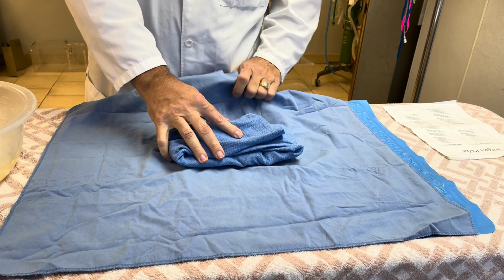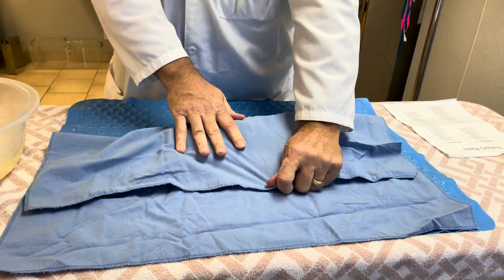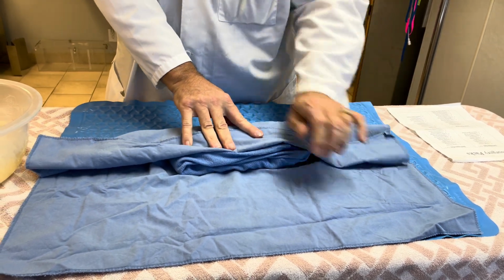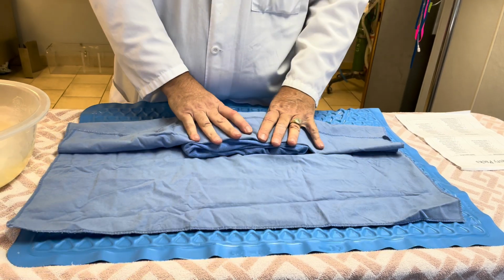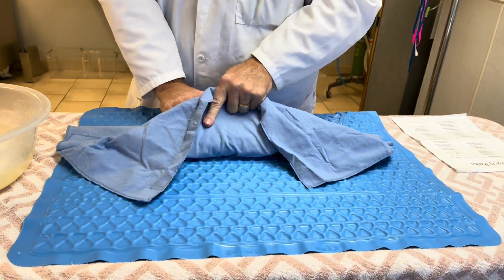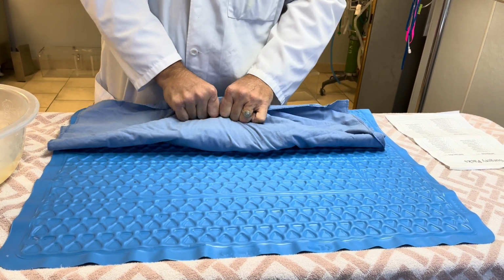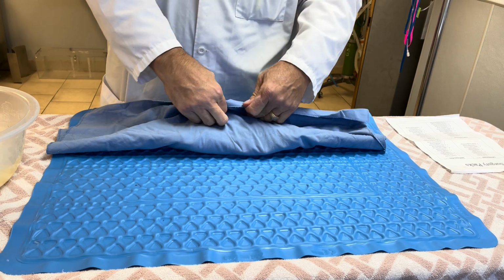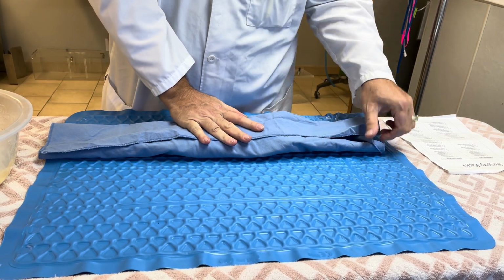All right, now this is the more important wrap. I'm gonna pull this up like this and then fold it back. We don't wanna just fold it over. This is for aseptic technique, we have to have this correct, okay? And so when the doctor grabs this, when he or she is gloved up, now we want to see how I'm making this tight as I'm pulling it each time. You want it to be tight, okay? And then fold this back, okay?